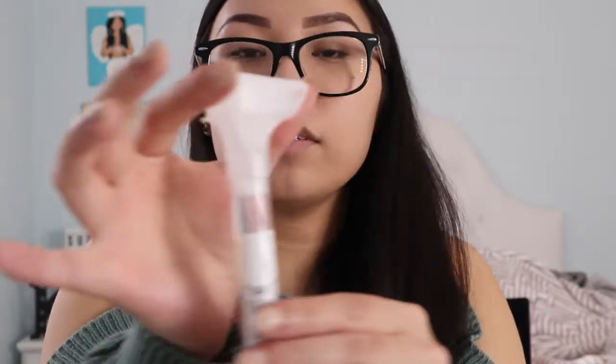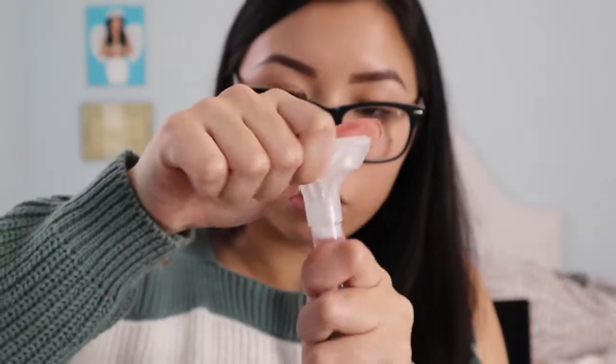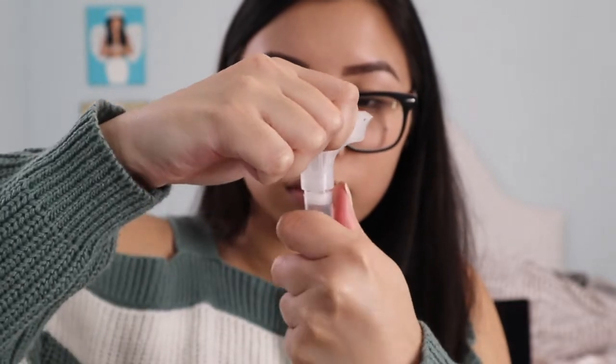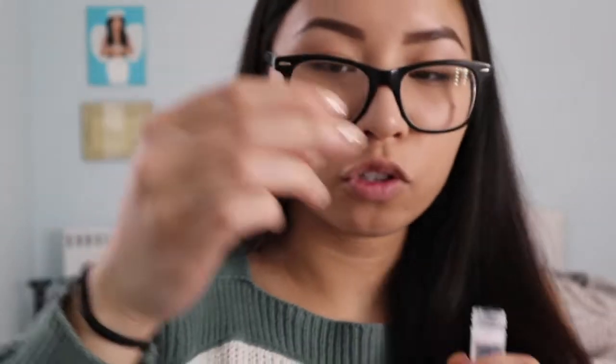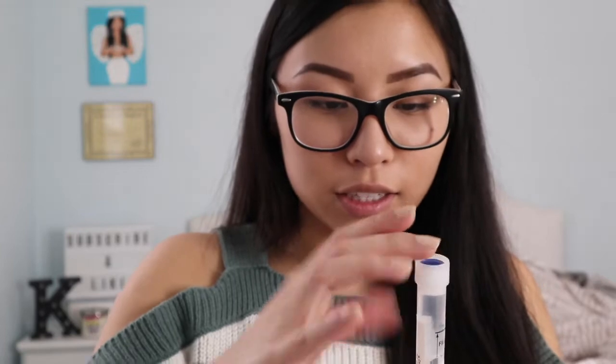Okay, so now we have to take off this part — we're gonna unscrew it. This is the cap that we're gonna screw on. Shake the capped tube for five seconds.